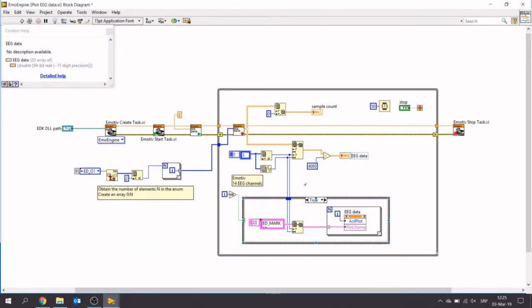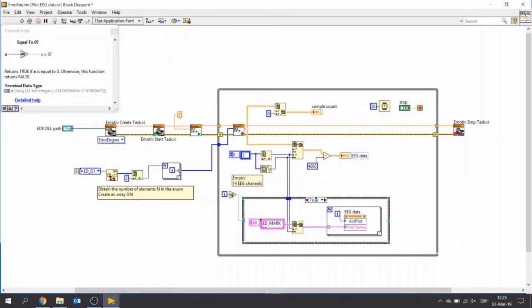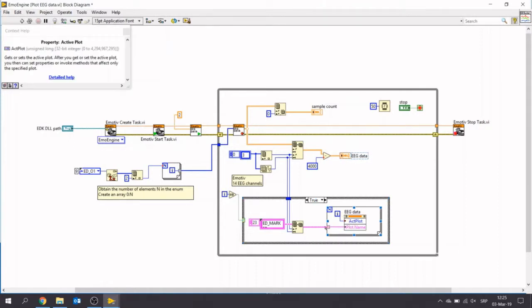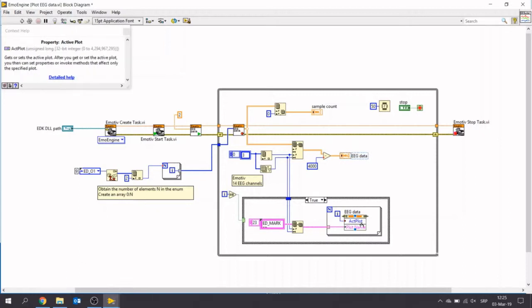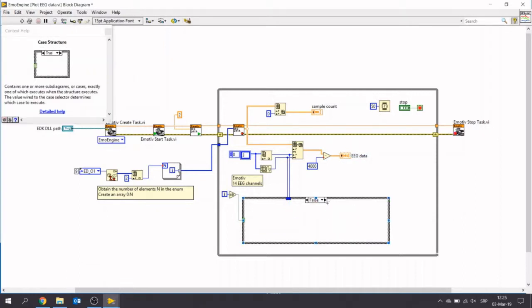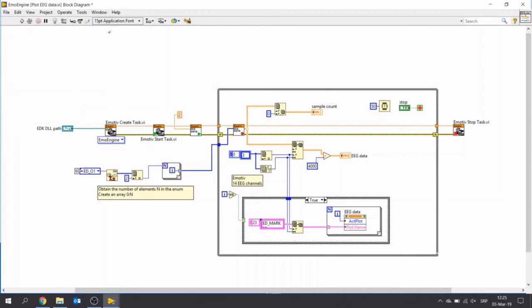Okay, so in the first iteration, when iterator is equal to 0, we are going to clear the graph. So we are going to set the plot name and see which plot is active. And when it's false, we are not going to do anything. Okay, so this is a quick demonstration of how the block diagram for basic Emotiv data acquisition looks like.